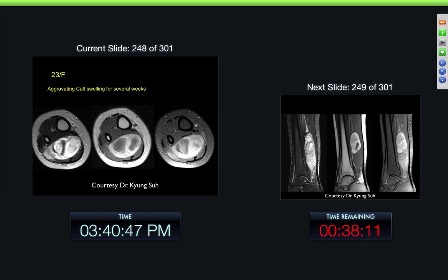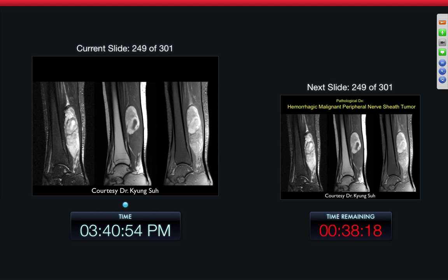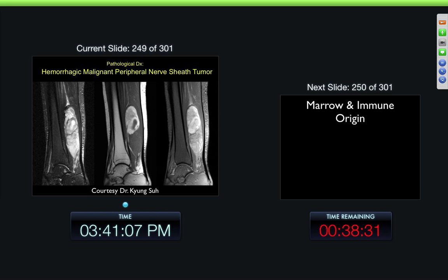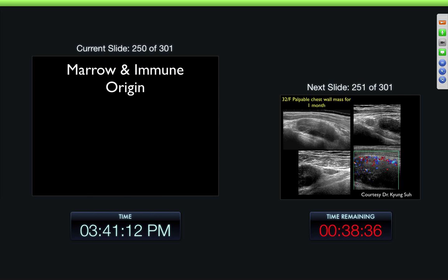23-year-old female, aggravated calf swelling for several weeks — very inhomogeneous picture here. This is a huge lesion extending way down here with markedly inhomogeneous sections within the lesion. This really looks like it's more of a malignant type thing, and this was hemorrhage inside of a peripheral nerve sheath tumor.